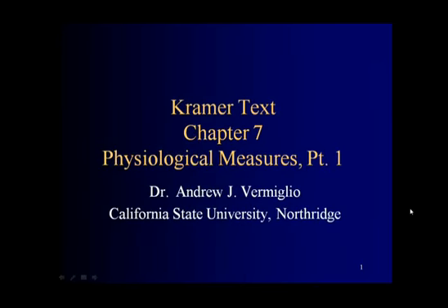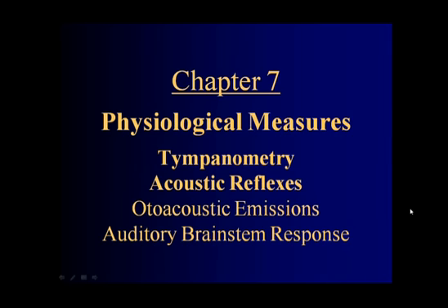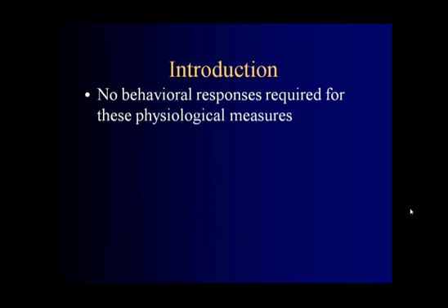This is Dr. Vermilio. In this lecture, we'll review physiological measurements. Physiological measures include tympanometry, acoustic reflexes, otoacoustic emissions, and the auditory brainstem response. No behavioral responses are required for these physiological measurements.